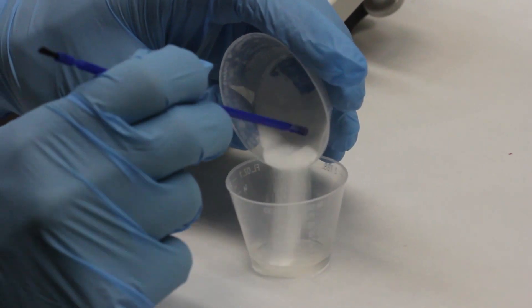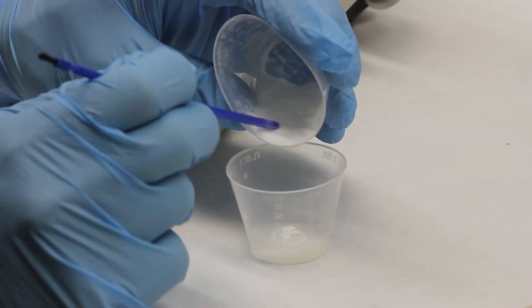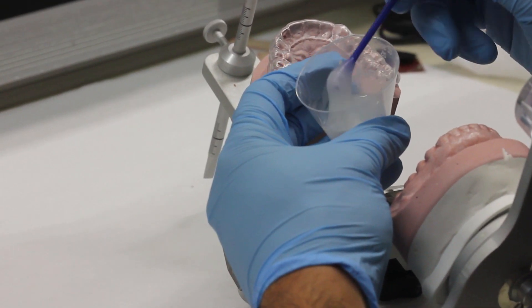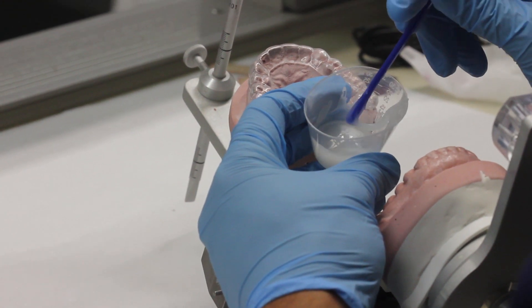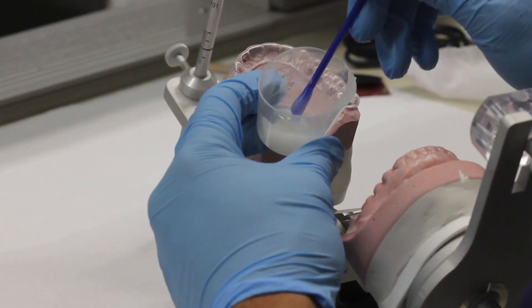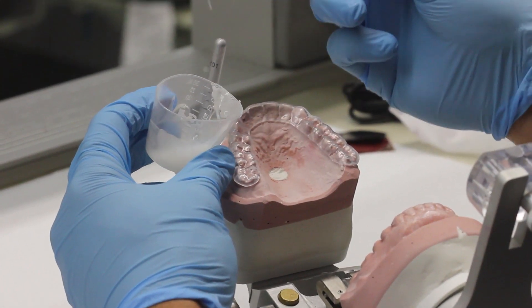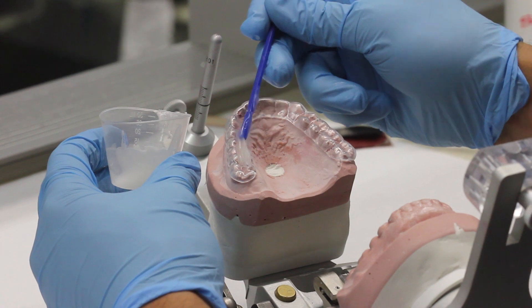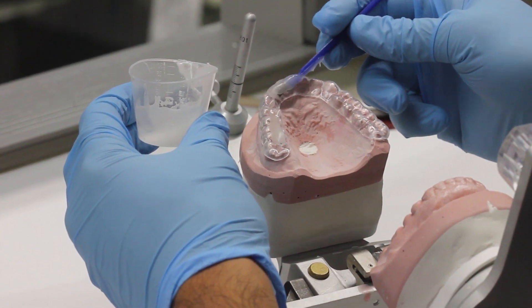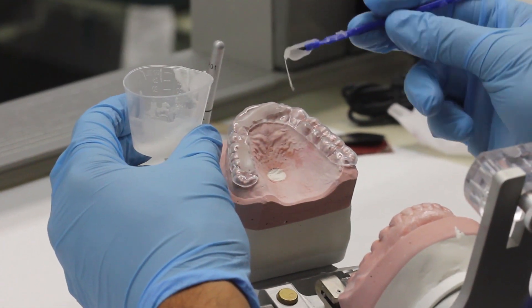Take your powder and mix it with your monomer — remember, this is a chemically activated acrylic, so it's going to go through differing stages of polymerization. We're going to wait until it gets to just before a doughy stage before we place it onto the splint. You don't want it too runny, otherwise it'll spill everywhere, but you don't want it too doughy where it won't mold to the opposing teeth. It's almost like a warm honey consistency. Once you reach that consistency, start to layer it onto the splint, visualizing how much space there is between the casts so you know approximately how much material to place.